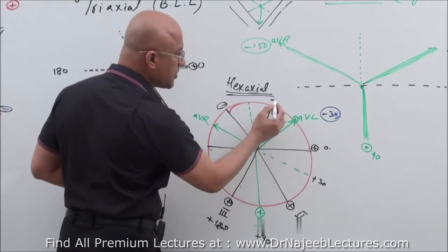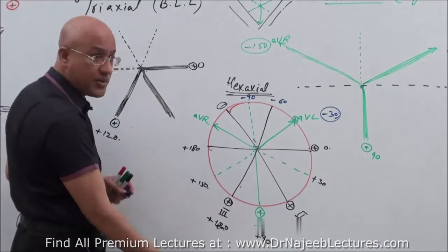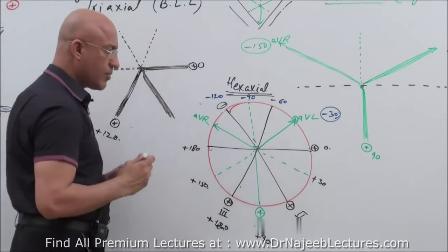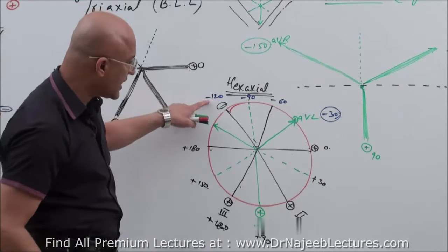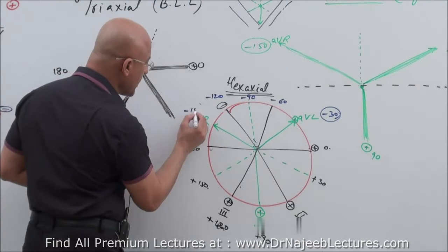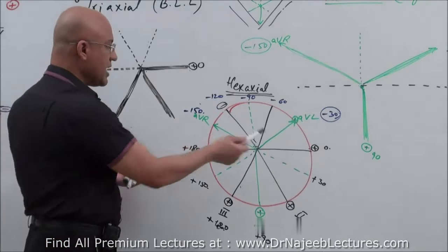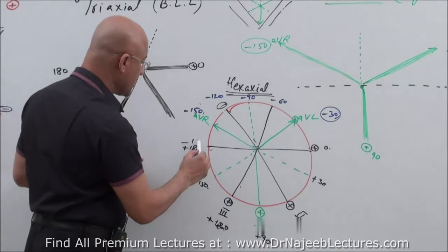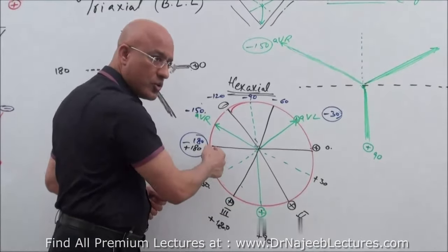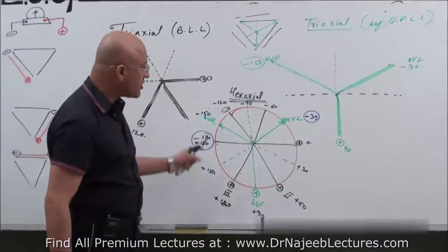There is nothing at minus. This is the negative pole of lead number 3 at minus 60. At minus 90, there is the indifferent component of AVF. Right? Minus 120, what is this? The negative end of lead number 2. And minus 150, AVR, positive electrode, exploring electrode. And as you move in the minus direction, this is minus 180 also here, the same thing. Right? Clockwise, you put positive designations at every 30 degrees. Anti-clockwise, you put negative. This is the hexaxial diagram.